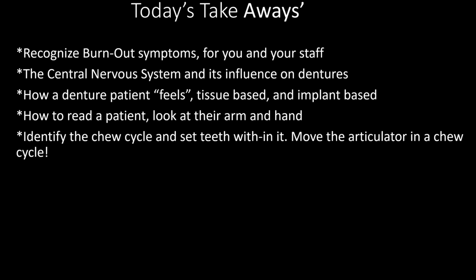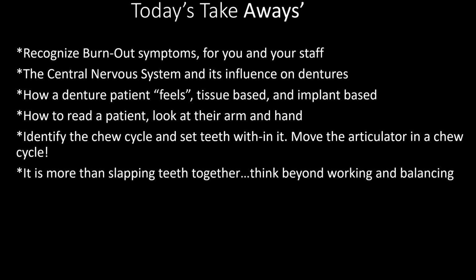Identify a chew cycle, set teeth within it, move the articulator like the chew cycle. Remember, it's more than slapping teeth together. Think beyond. You cannot separate the mouth from the person. So my sincere wish is to support you regardless of your position and the patient that places their trust in you, in that line, in that pie, whether you're the technician, the denturist, or the doctor. So my goal is to do that.